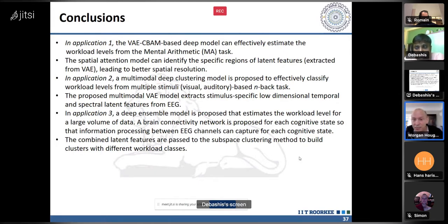And so part of that, as I'm sure there's a big difference, is the windowing choice that you made. I forget how long it was for the mental arithmetic, but you have to choose this window, and over that window, it's not always mental arithmetic, right? We just know that it's in there somewhere. The same thing with the N-back task. I think you had like 3 seconds there. This is work that is very dependent on our task and the task's ability to keep a person doing something during that period of time. It's definitely rough.